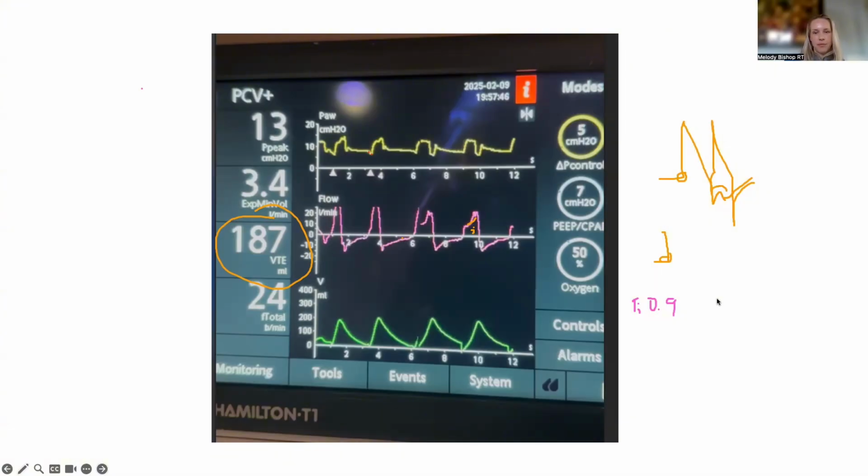Then normally what'll happen is they'll just start breathing at some number. If they're not paralyzed, they'll breathe at like 13 or something. If you dial in the rate that the patient wants, then you just get the ventilator out of their way, if you can't safely lift their sedation for some reason. Although there's very few reasons why you need to be at -5, unless you're paralyzed or whatever the case may be. Usually you can lighten the sedation and get out of it that way. But if the machine rate is close to the intrinsic rate, the machine can get in the way of the patient's intrinsic rate. So if you just drop the machine rate, you just let the patient do what they want. You know what I mean?